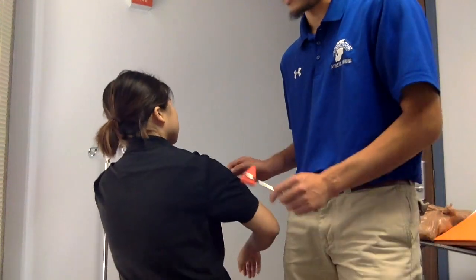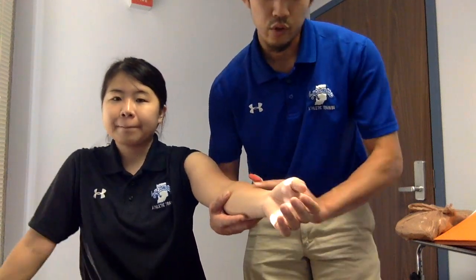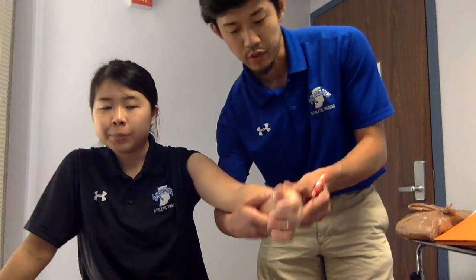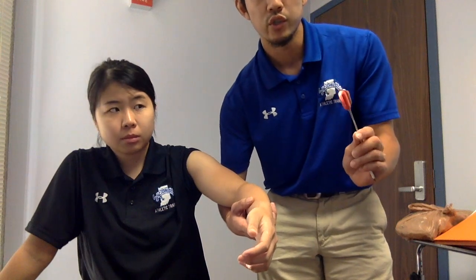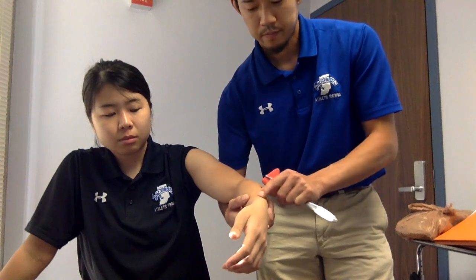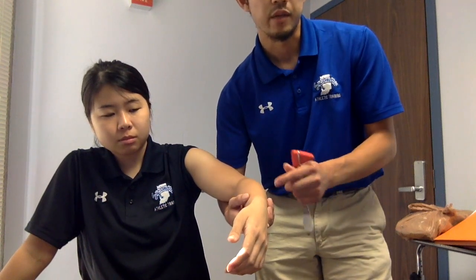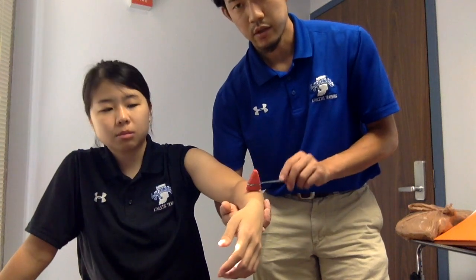Next, for C6, you will use the brachioradialis tendon. The tendon lies on the lateral side of the elbow, which goes to the radial styloid process. You will use the broad side of the hammer, because this tendon is just a little bit wider than other tendons. For a normal patient, you will see a reflex, and the movement is radial deviation.